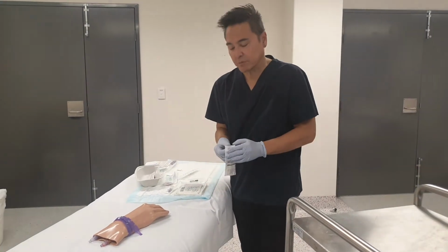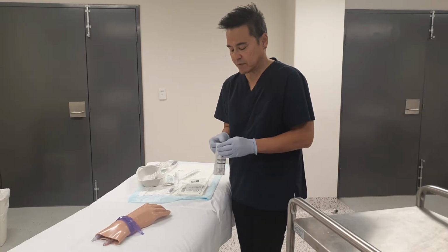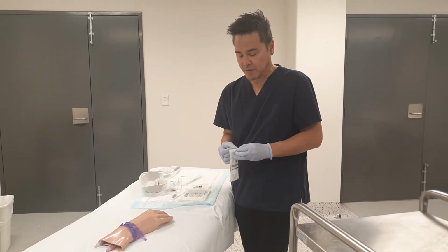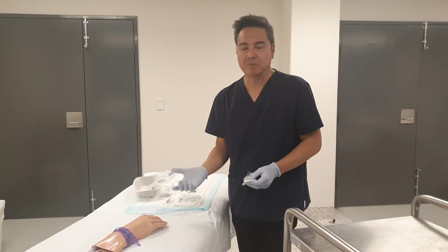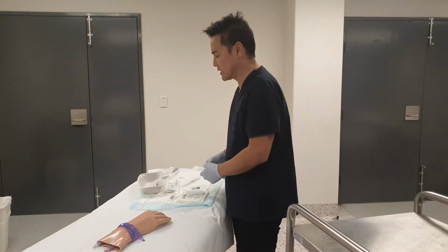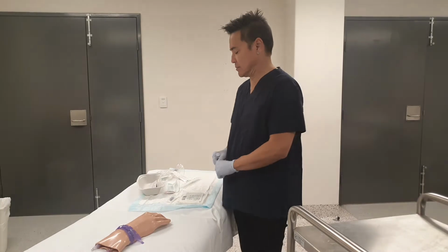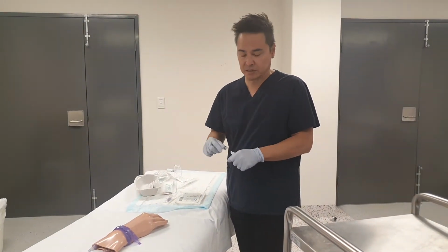So again, practice drawing up your flush. All this sort of stuff needs to be done really smoothly. Putting on your tourniquet on the patient, practice putting tourniquets on in class. If you're not good at putting tourniquets on and you're fumbling around, your patient's going to feel it, and they're going to lose confidence in you, and that's where they're going to ask you questions that are really awkward for you guys. Like, have you done this before? How many times have you done this before? You're too old to be in med school. You're too young to be in med school, whatever.